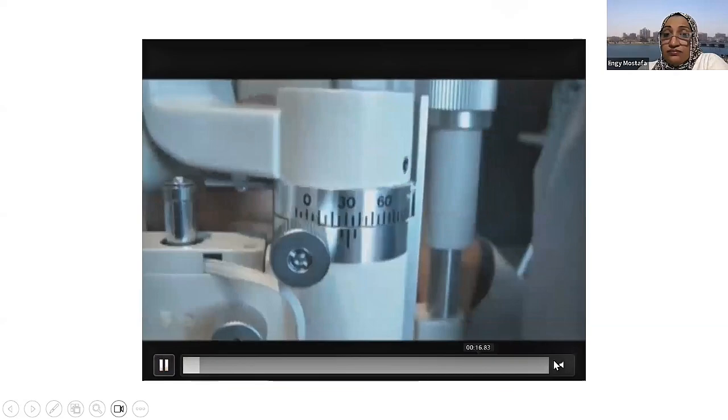So retroillumination: here, we are putting the beam on the iris while focusing on the cornea. We are looking for small scars, corneal vessels, microcysts, and vacuoles, with the illumination making it high contrast. So we are putting the illumination on the iris, but the focus is on the cornea. Here's the light, but here is the focus. We are focusing on the cornea.